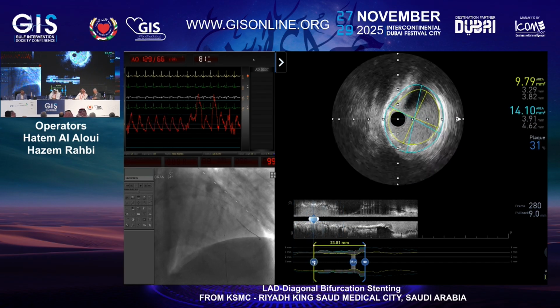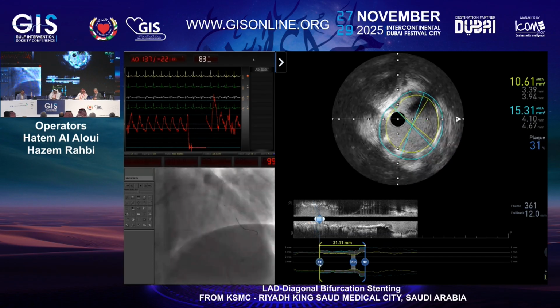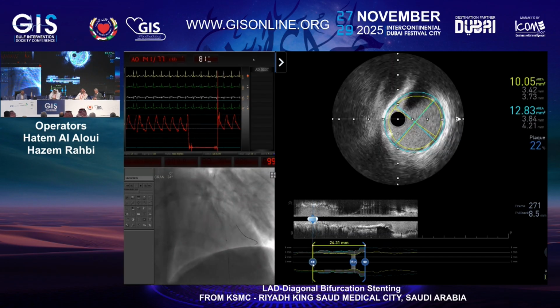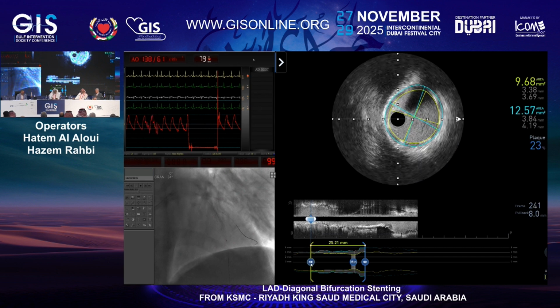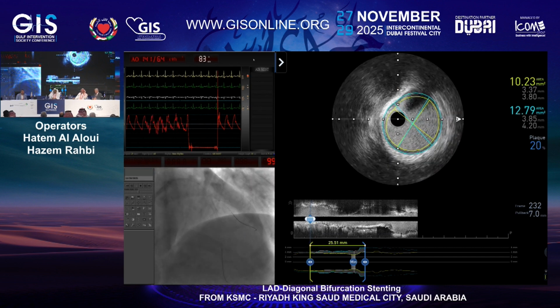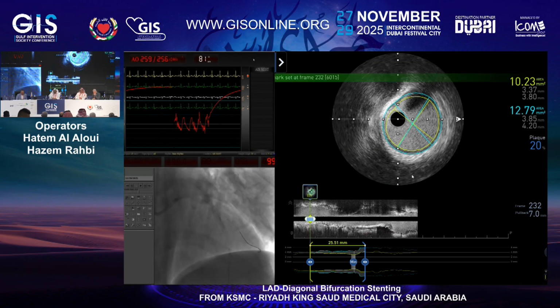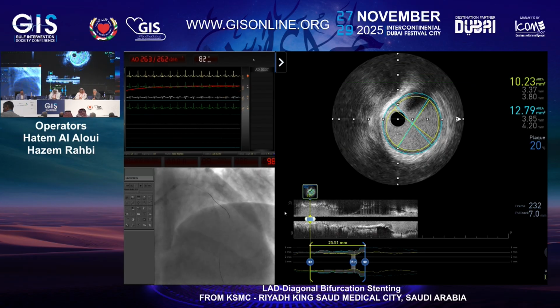Let me take you through this automated assessment. Just give me a puff to see how the flow is on the diagonal. Before we remove it, you can see the plaque burden is a bit more than 20%. If we bookmark this, you can also get the percentage stenosis like with OCT.